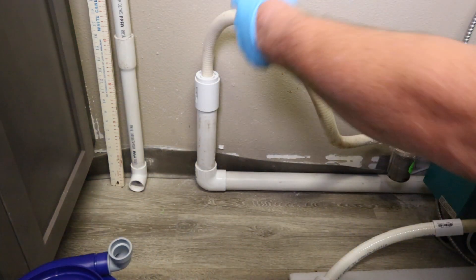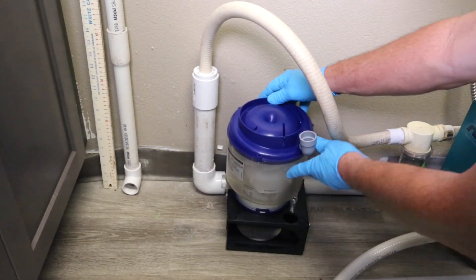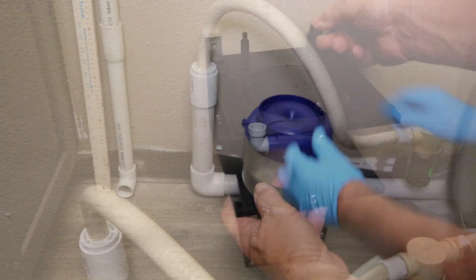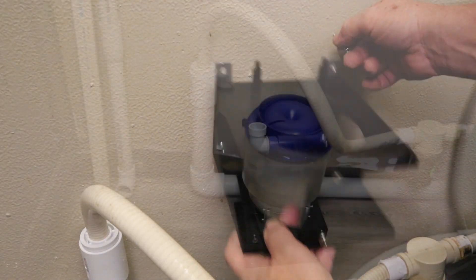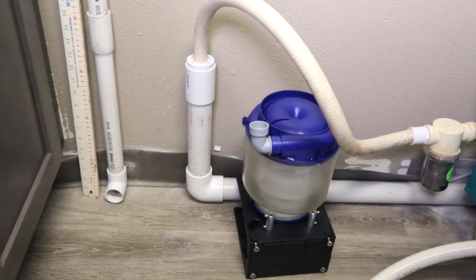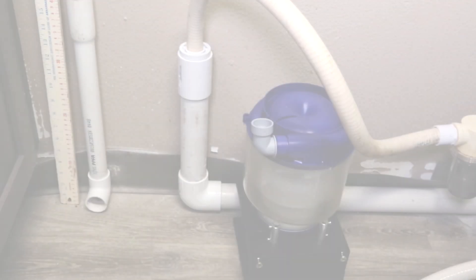After assembling the Eco2, identify the exact location where you will install the unit within the piping system. You can request wall brackets to secure the unit to the wall, or you can use the black foundation brackets to leave the Eco2 freestanding on the floor or level surface.